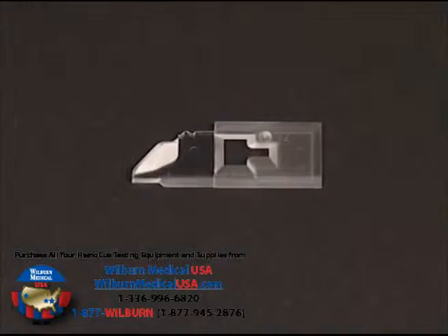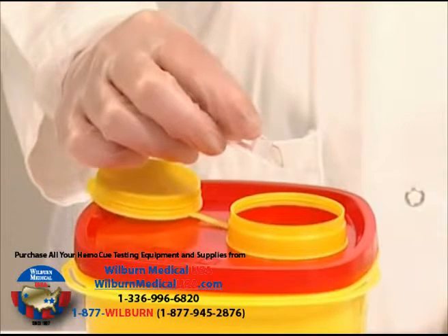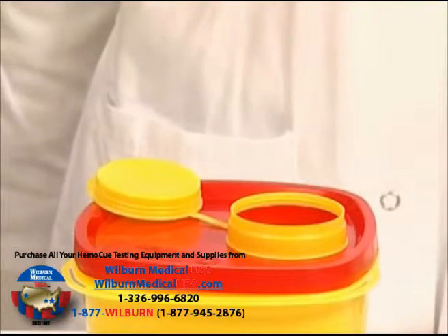Although all of the reagents are present in the cuvette in extremely low quantities, local environmental authorities should be consulted for proper disposal. Always handle body fluids with care, including urine samples, as they might be infected.